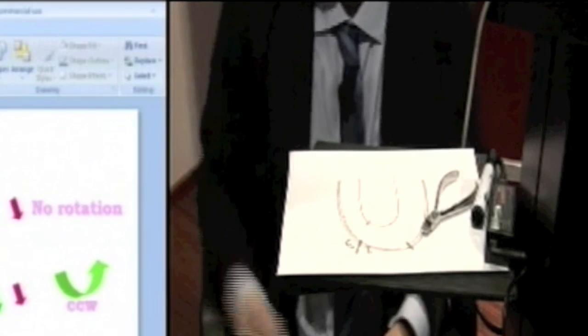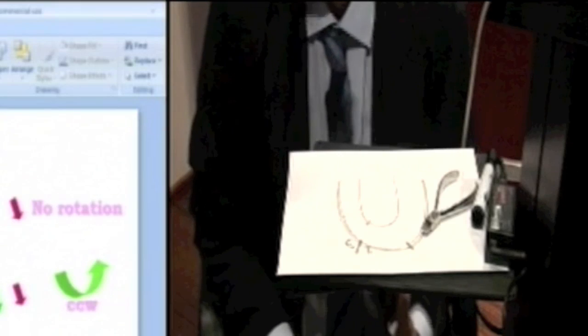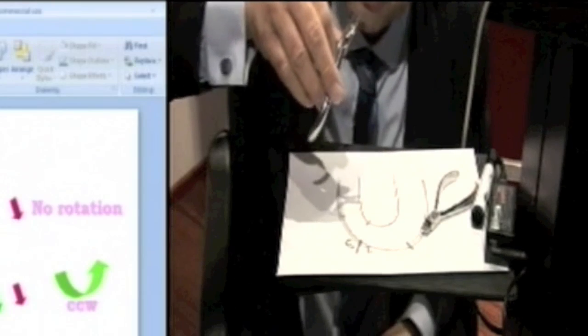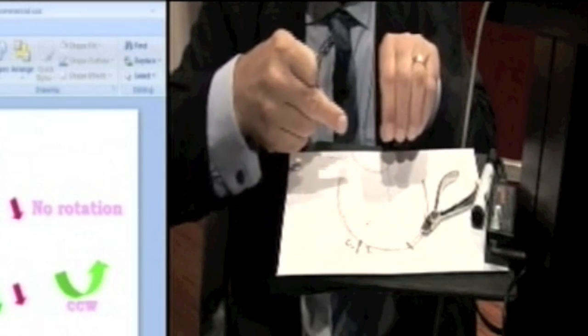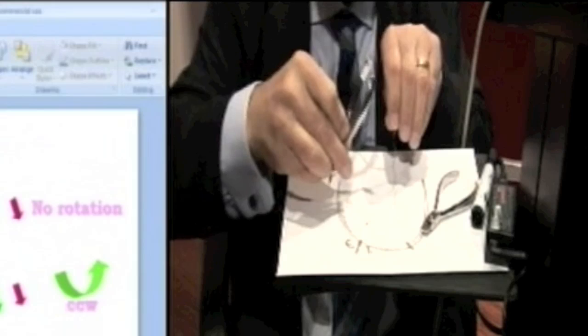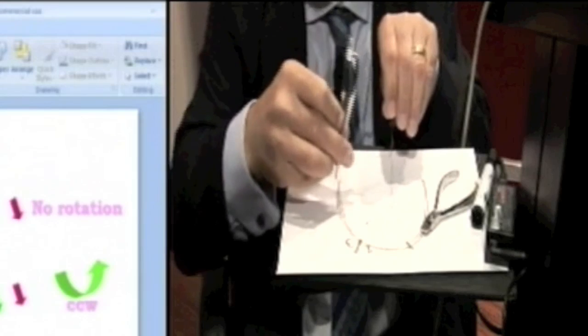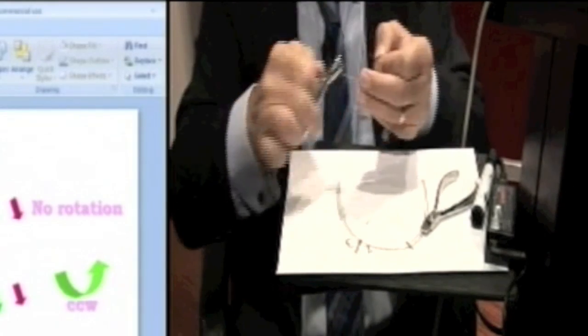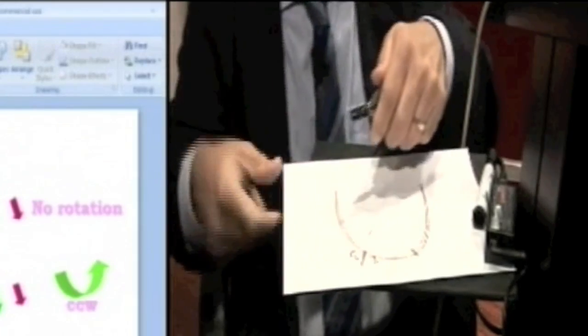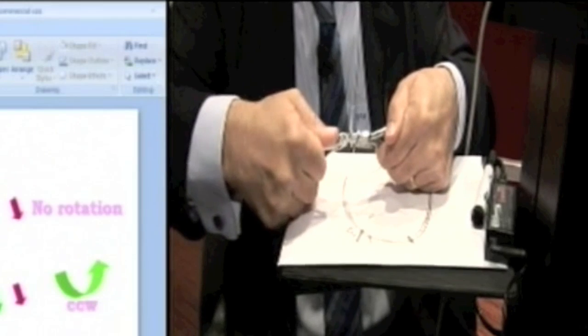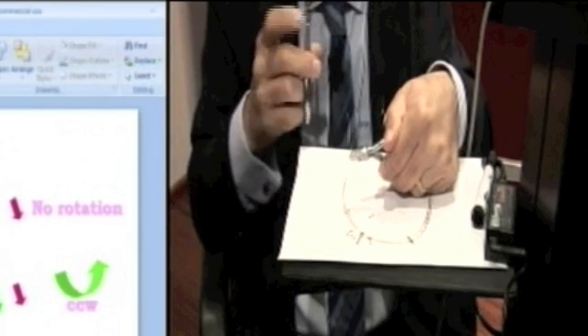Let's just say I did my first order bend, and I sent the patient away for six weeks. The crossbite looks better, but now I see that all those teeth are tipping. Now I want to upright them. I can, in that same wire, just put in progressive torque in the buccal segments. So what torque would that be? That would be torque where my root needs to move this way. If my root needs to move that way, my crown moves inward, so it is actually negative torque. I'm going to grab this now, maybe in the region of the premolar. I'm going to bend it 20 degrees down. Now, if you look at that goalpost, can you see that?